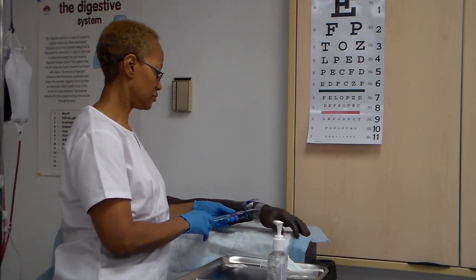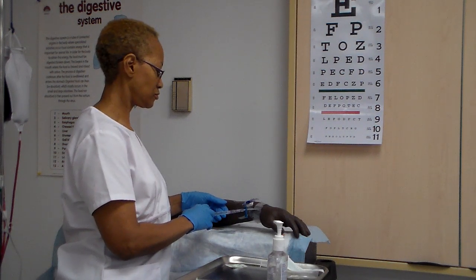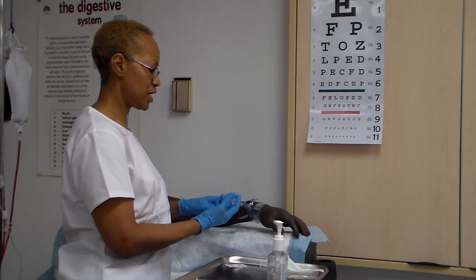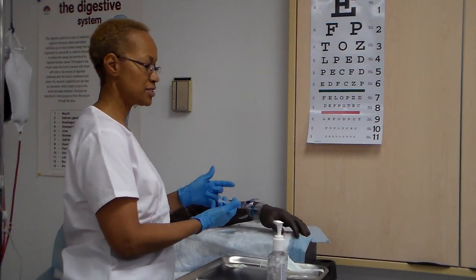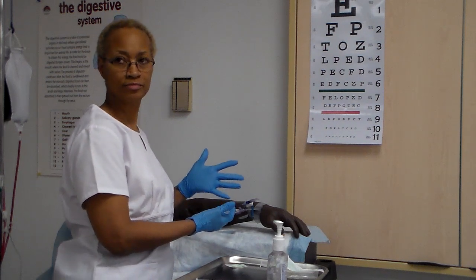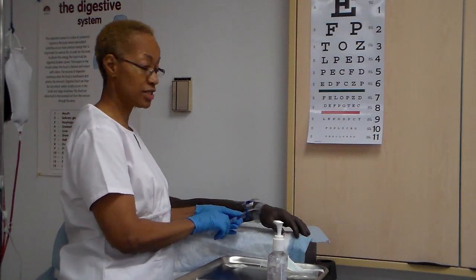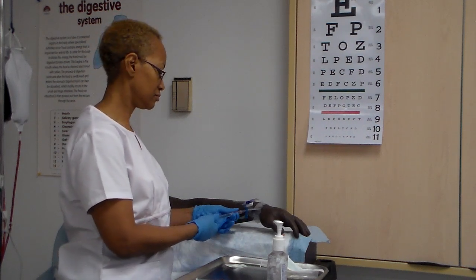Okay? Go ahead. Inject medication within amount of time recommended by institutional policy, pharmacist, or medication reference manual. Okay, and we talked about making sure that you're timing the medication. If it's going in, it may say you can give 3 mLs over 5 minutes. Okay, there's a system that you're going to calculate this out, and we're going to do this in medication calculation class. Okay. After administering bolus, withdraw syringe.